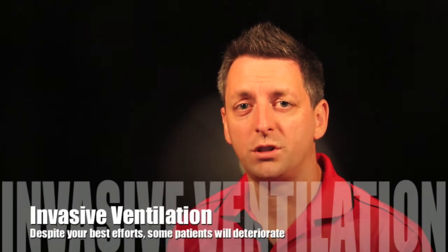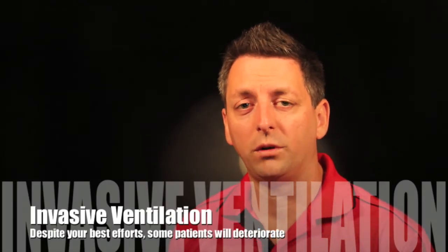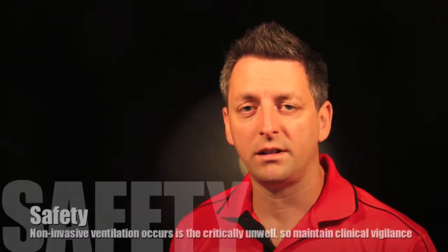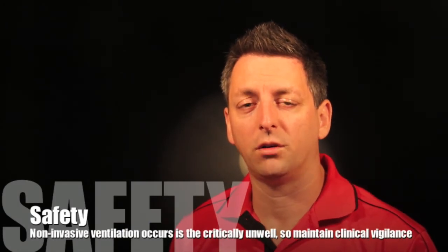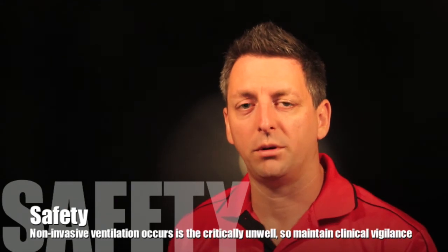So what do we take away from this video? Don't forget, the people receiving this are severely ill, respiratory distressed people. So there is a good chance that they do progress onto ventilation, but what we're trying to provide is an opportunity to give them the chance for their body to recover enough so they can start breathing on their own and fly again. Also remember, it is very labour intensive. You need to be with the patient all the time, but don't forget there is a good reward at the end trying to stop a person being ventilated.